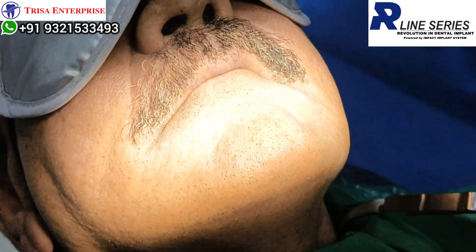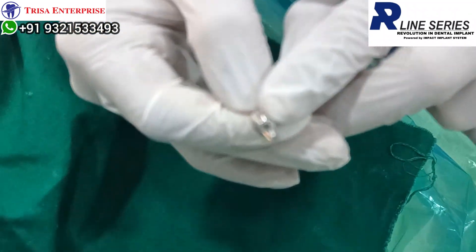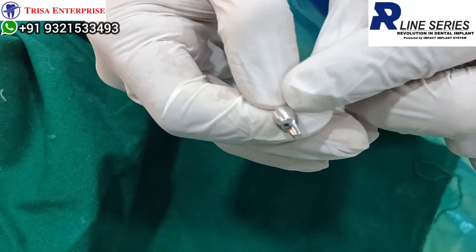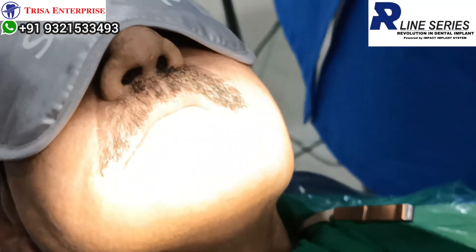I will show you a little bit more on this point. So this is the adapter — this is the BCS implant. You can see this adapter has been screwed onto the implant. With the hand driver, you just put this adapter, and you will not have to do any retrofitting cement at all.